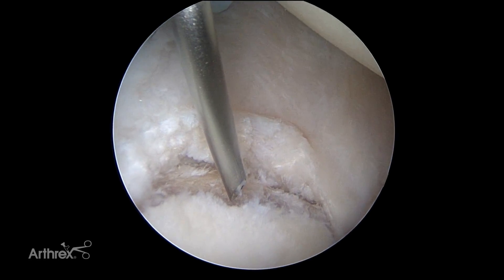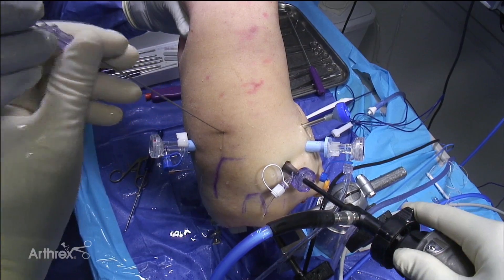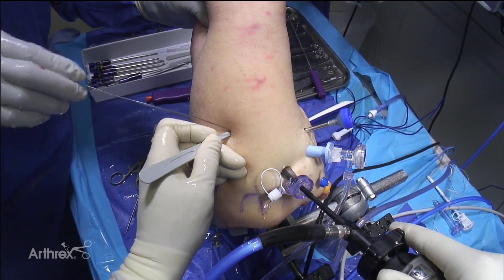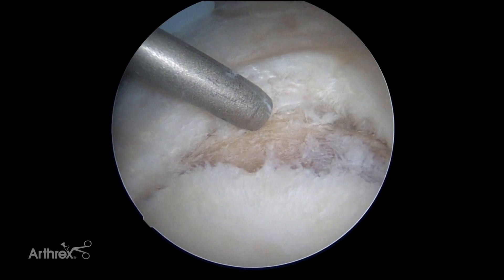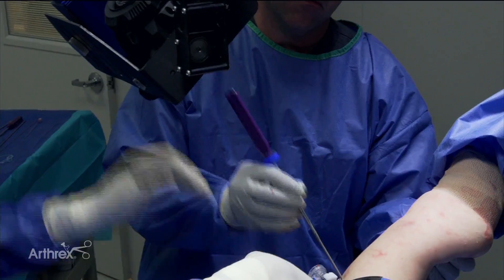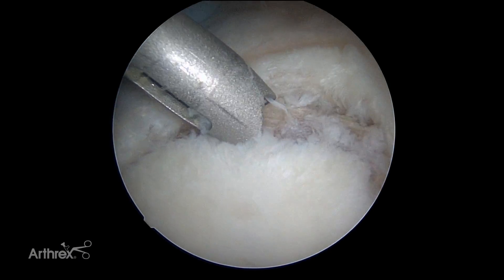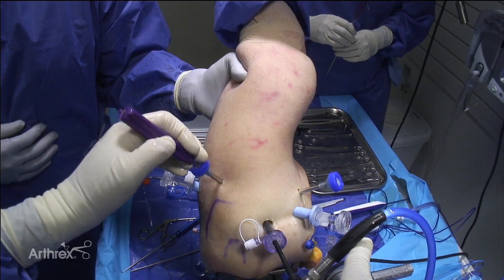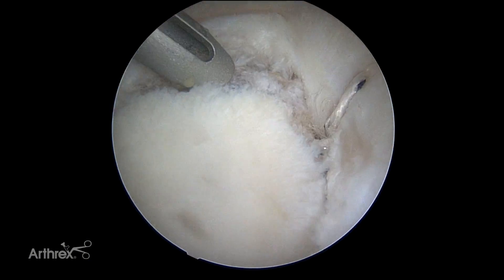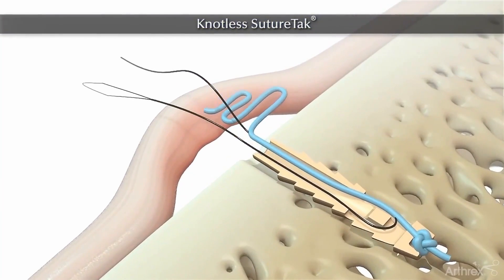Next I'm going to get my most inferior anchor. We put the rod down, make a small skin puncture right alongside it, get the first dilator down, and visualize to be sure it went all the way. We'll use the spear and metal cannula assembly for this as well. Up until now we used to say that in order to tension things inferiorly you need to tie knots — but with this knotless suture tack, that's not necessarily the case anymore. There's a nice animation that shows how you pass the suture through the labrum.